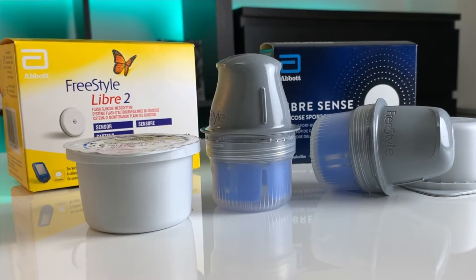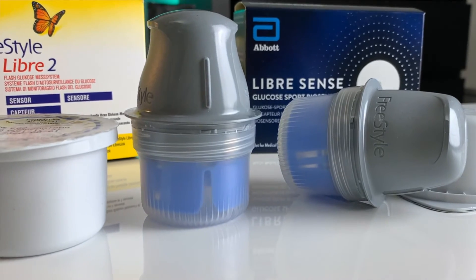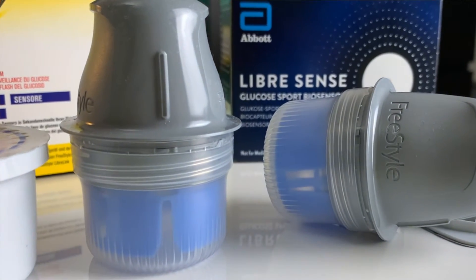They both look the same and in principle they are exactly the same thing: continuous glucose monitors. LibreSense uses the Freestyle Libre continuous glucose monitoring technology, so it makes sense that they do the same thing. But let's talk about what the differences are and which one I like better.